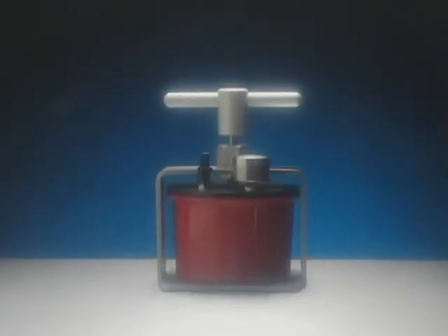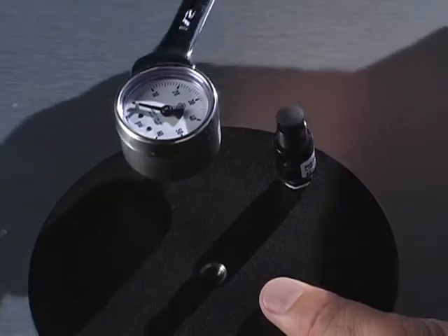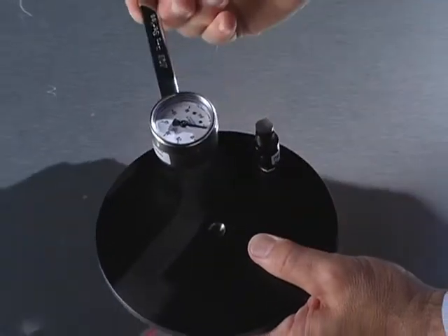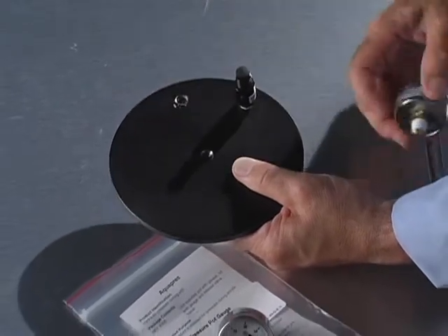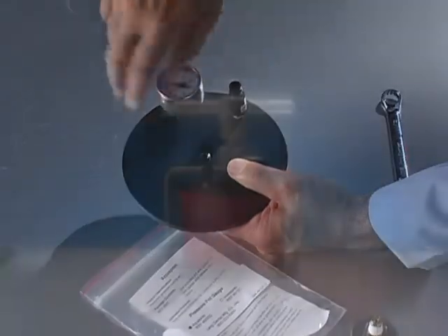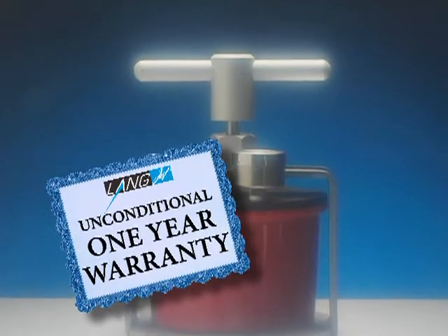Your Lang AquaPress is made of well-tested quality materials and parts. In the event the gauge or release valve needs to be replaced, you'll be able to fix it with a replacement part and a half-inch wrench. Here's how easy it is to fix — just remove the gauge and replace it. Changing the release valve is just as easy. Your Lang AquaPress is under warranty for one year. If you have any questions, call Lang or your dental supply dealer.